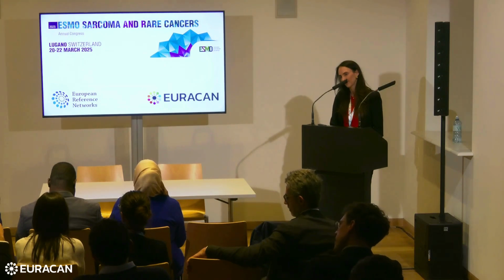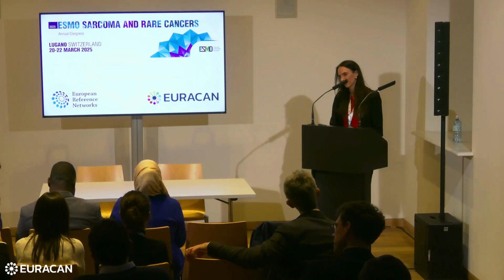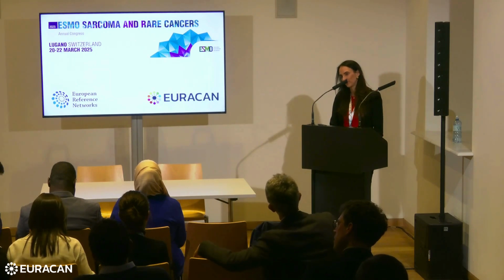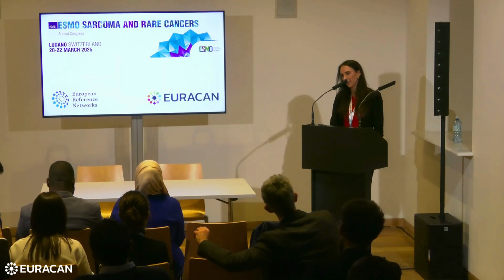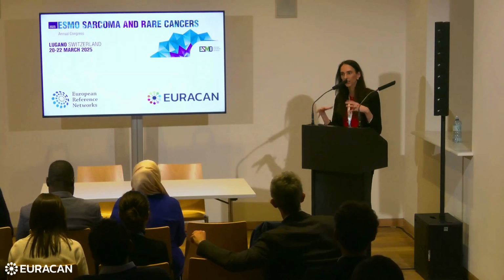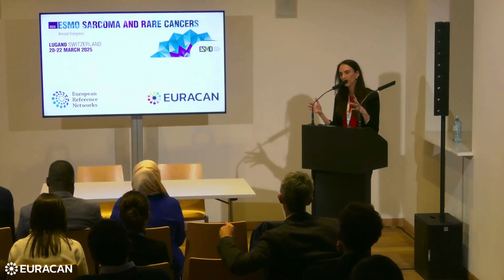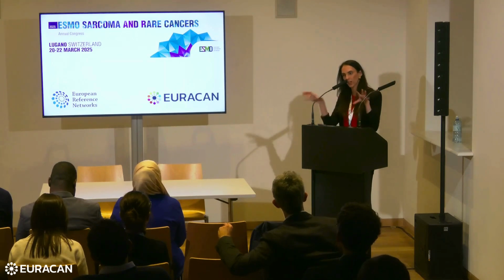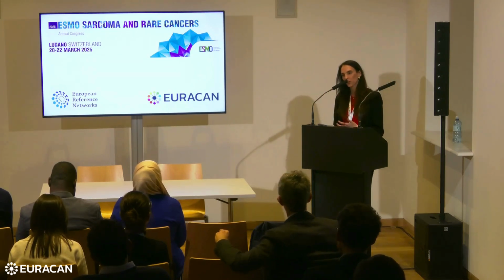Do you think that we should switch to volumetric assessment as for tumors? Because I think bidimensional is really tricky, especially with IDH inhibitors. Yes, and especially in slow-growing lesions, it's also very tricky. If you just use 2 diameters, it's always better to have volumetric measurements.